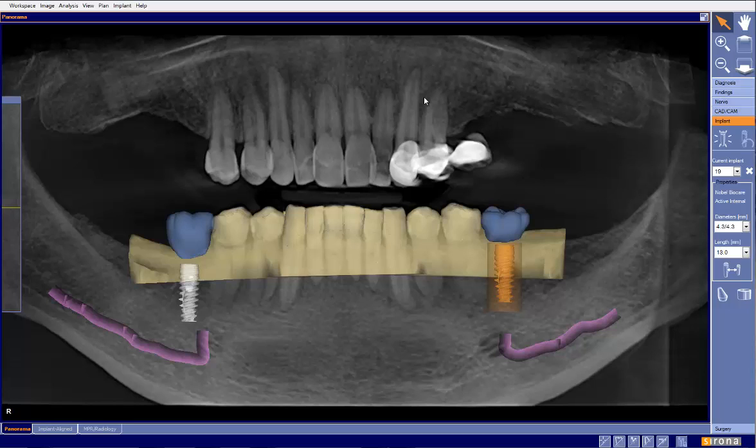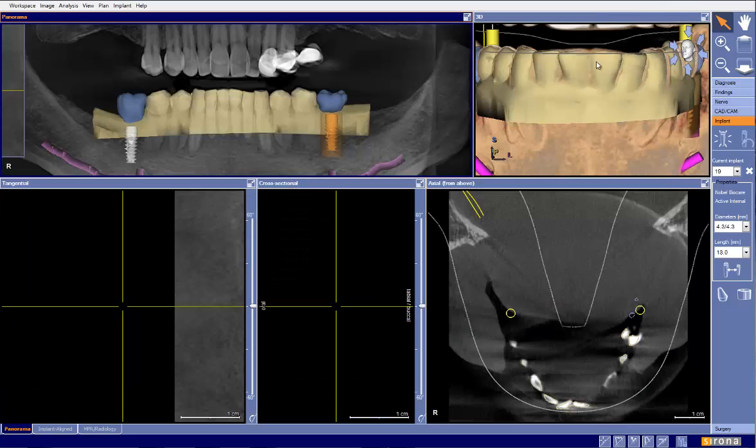And then he wants to evaluate number 30 and number 19. Number 30 has a minor defect and number 19 has a bigger defect. And then the patient will plan on doing implants in site number 3, 13, and 14 later. It's wonderful when you get into this game and patients start doing treatment and start doing implants step by step. It's a wonderful practice builder.